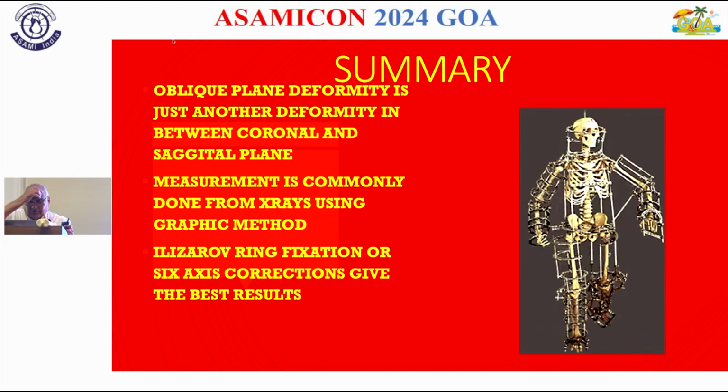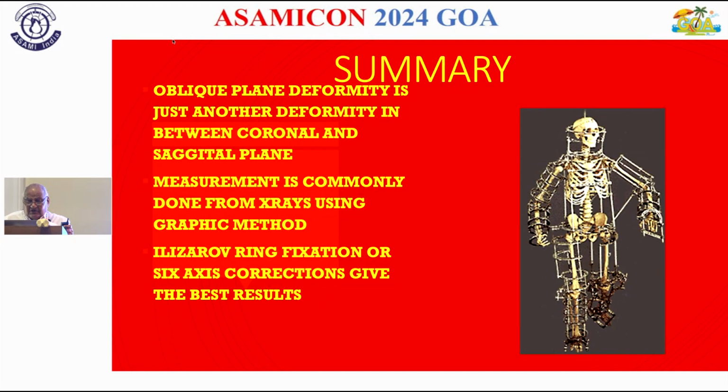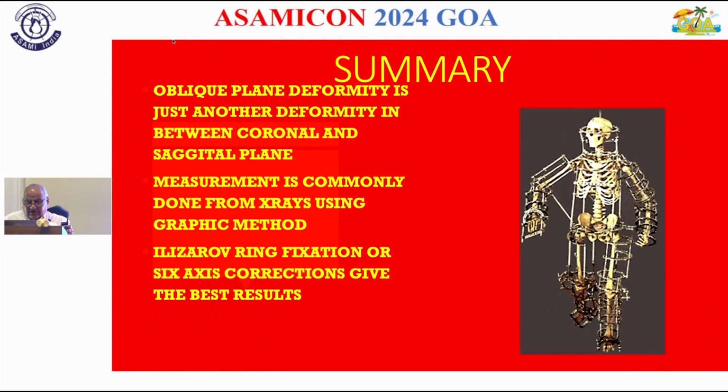Measurement is commonly done from X-rays using the graphic method. Ilizarov ring fixator or 6-axis correction give the best result.